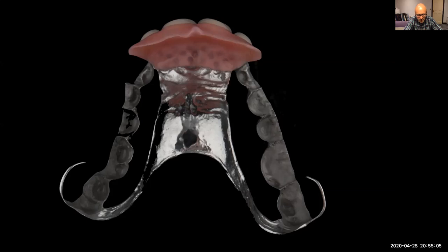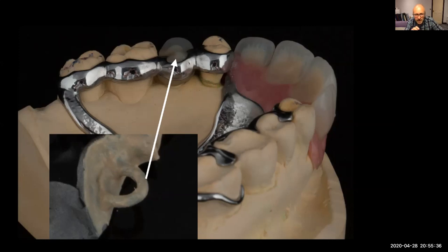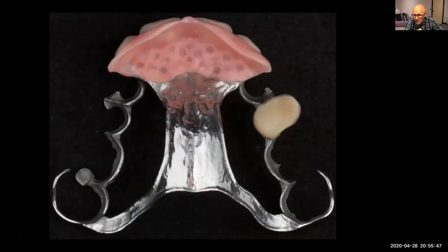Now, the great thing about these designs of denture, with the backings on, is that it's future proof. This is a different case, but it shows another patient who lost that premolar, so we needed to extract it. But because we've got these backings on here, it's been designed with the future in mind. We can add onto the backing. Chris can weld a tag here onto the metal framework, and then we can glue a new tooth onto the denture. This means that these expensive appliances, restorations, we can add to them, and they're future proof for a long, long time.